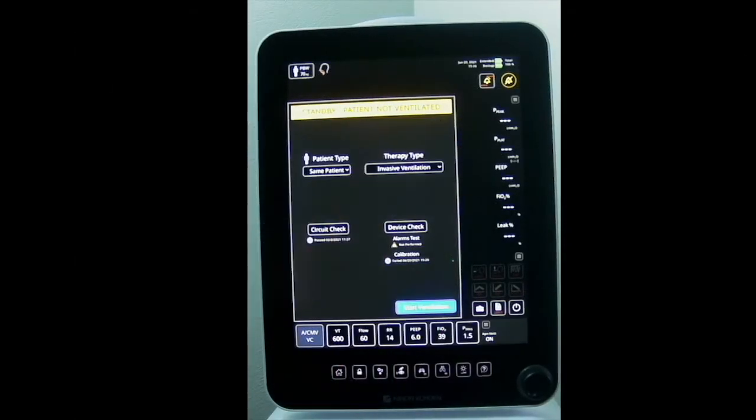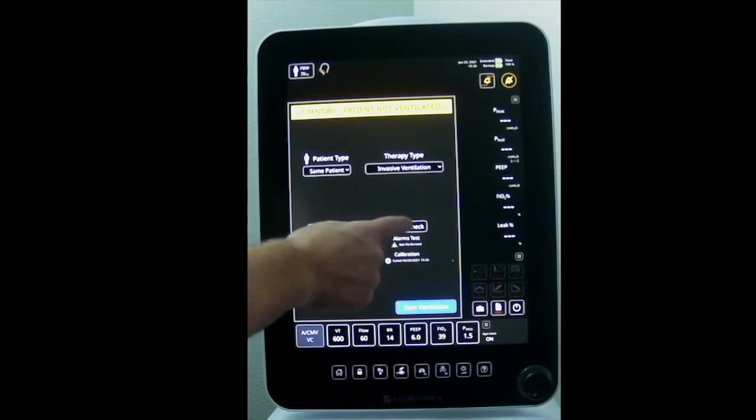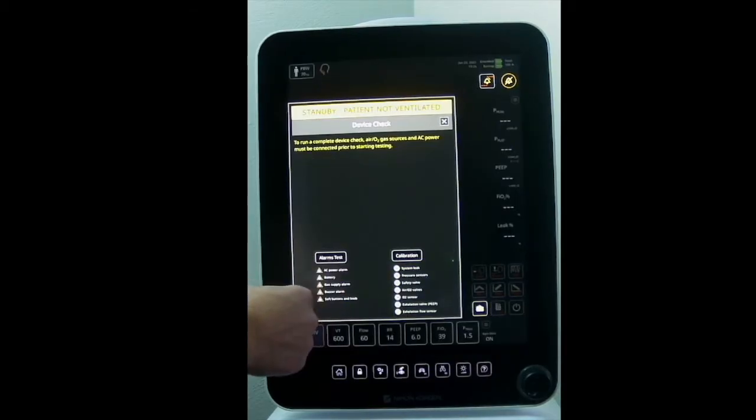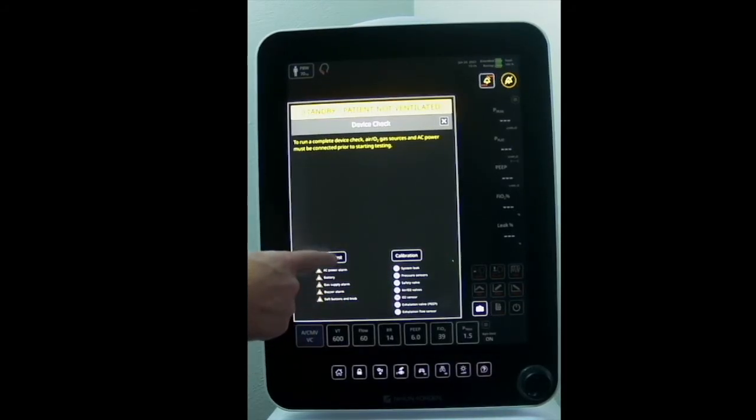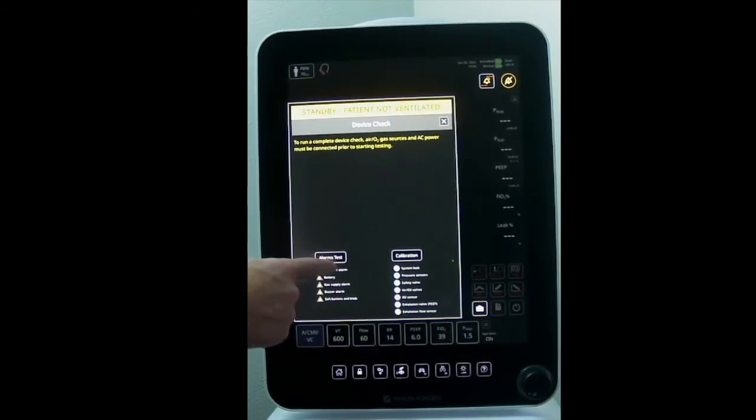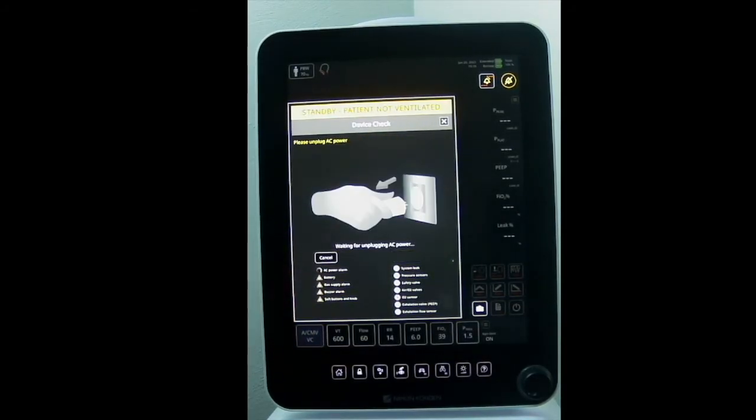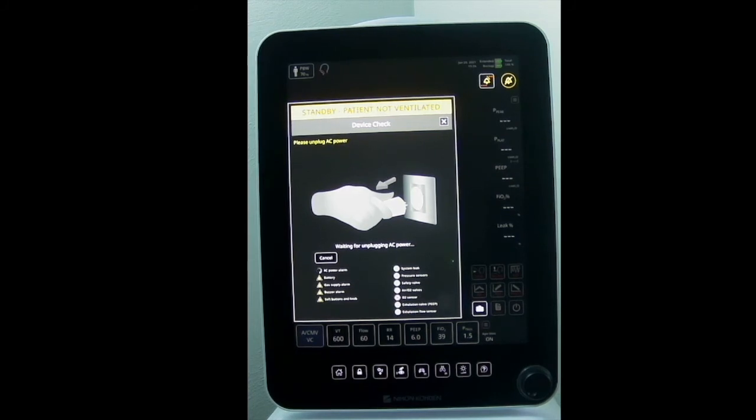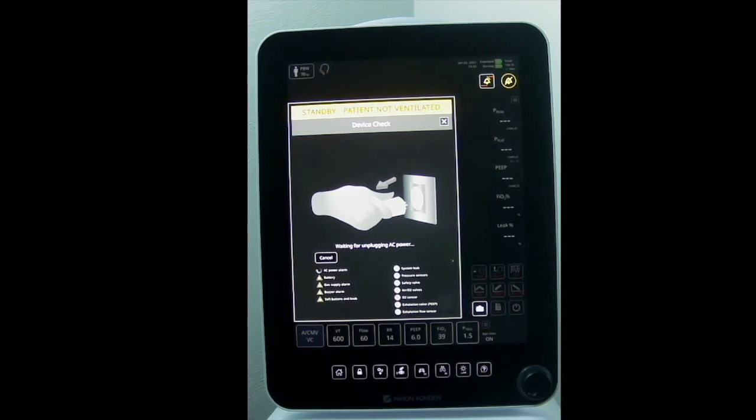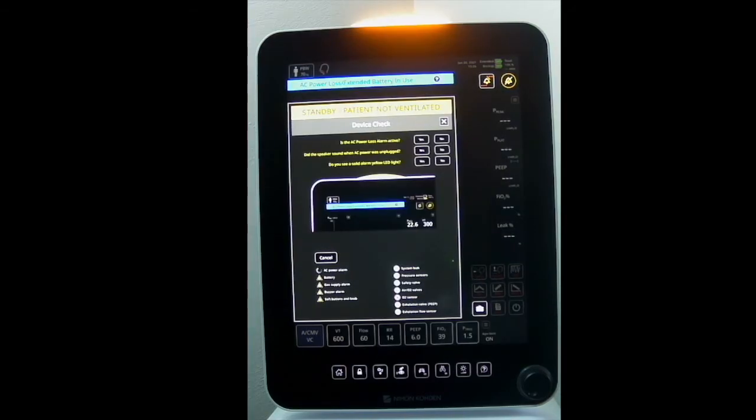Next, under my device check, I'm going to do the alarms test. I want to follow all the prompts on the screen. I do need to be hooked into AC power, and my air and O2 need to be hooked up also.